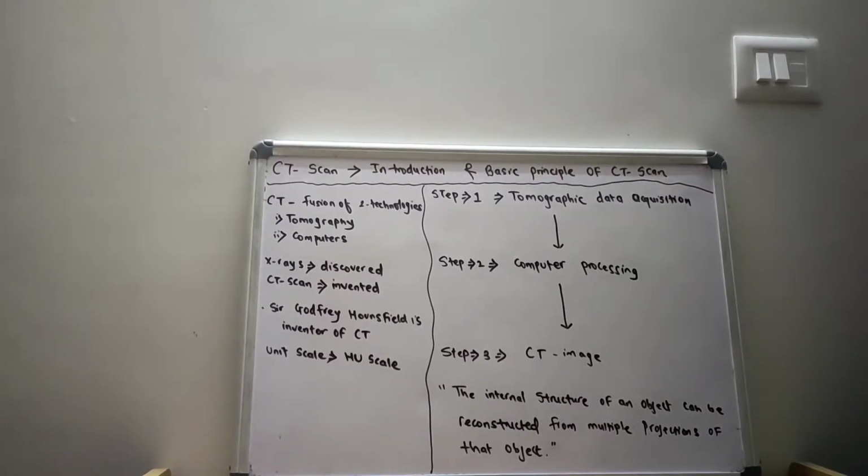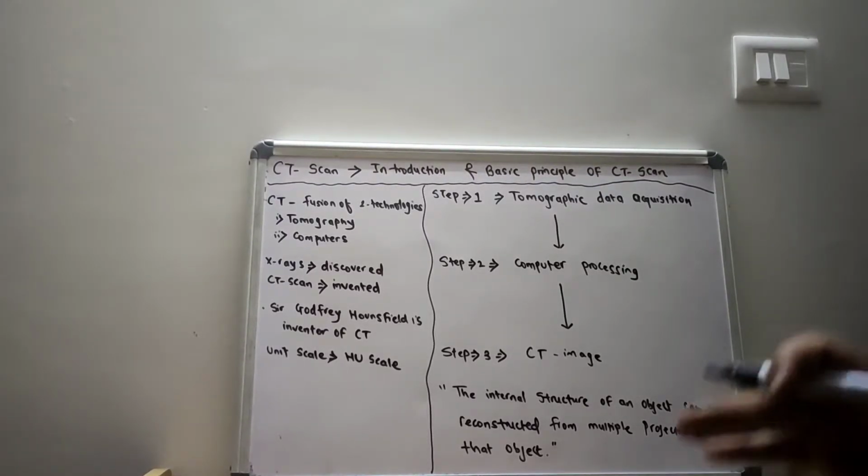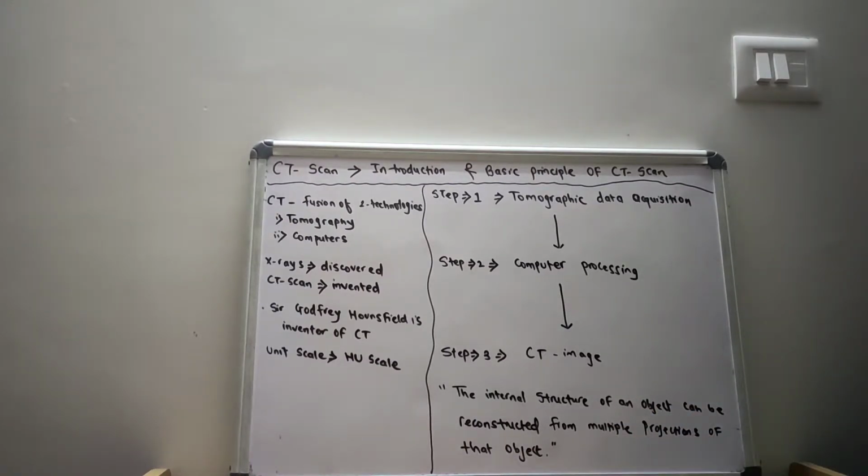Hello everyone. So today we are going to read about the introduction of the CT scan and the basic principle of the CT scan. So let us now move towards the basic introduction of the CT scan.